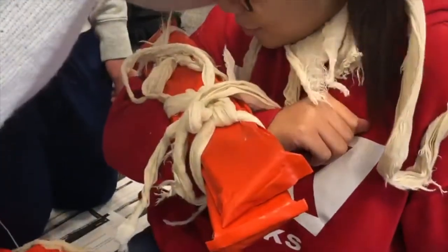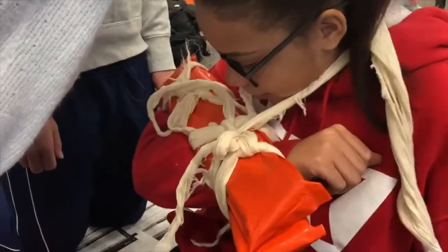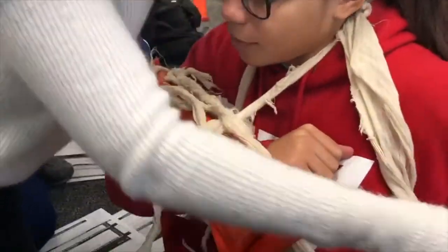Can you put her hand right there? Then tighten it a bit more. There we go. And then you're just going to wrap it around like that.